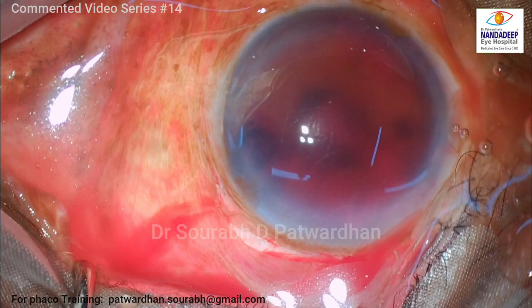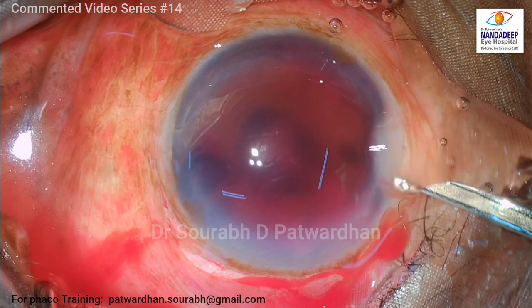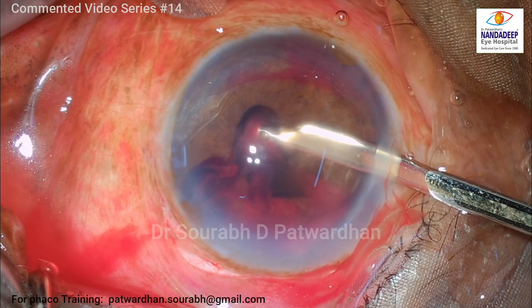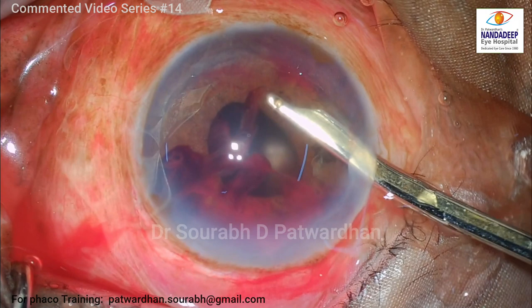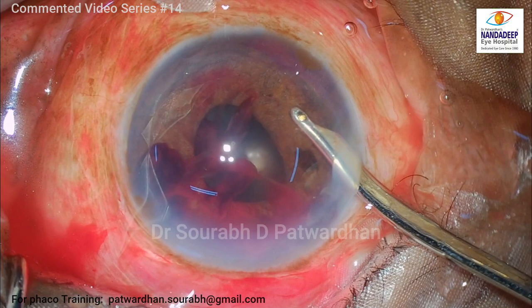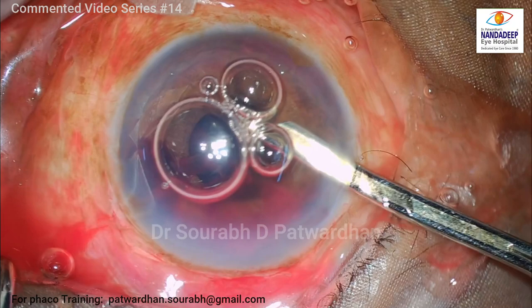What I'm going to do first is wash off the liquefied blood using a Simcoe cannula. The important thing here is not to pull on any of these clots. Try to avoid pulling any clots because, unless they are free clots, if you try to pull from the place where they are adherent — which is the place from which the bleeding has occurred — there may still be a bleeder there. If you pull it off, it will bleed again and lead to secondary bleeding. So this Simcoe is just to wash off the free clots and not to remove the clot from the angle.